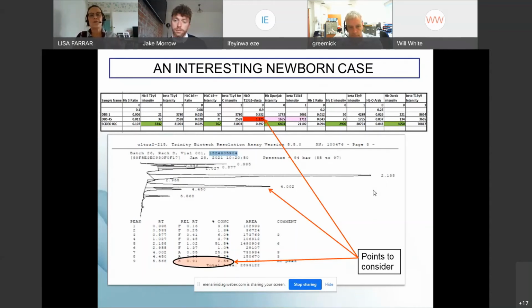The problem that we have with this diagnosis as a Primus user is we have a peak in a D position, we have a tandem mass spec result that tells us there should be some D there. So how do we report this? Do we report it as a D, follow the patient up and see whether it actually turns into a D, or do we have to do further diagnostic work?